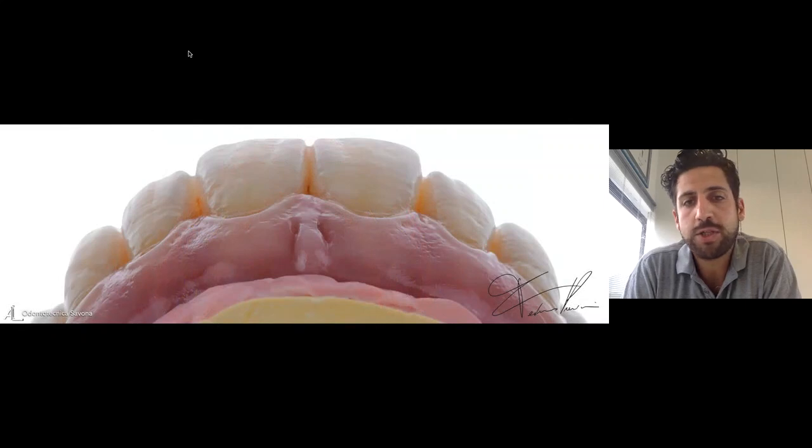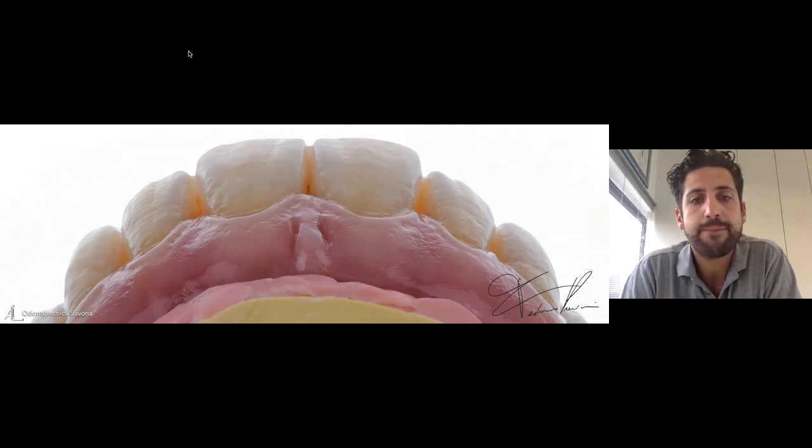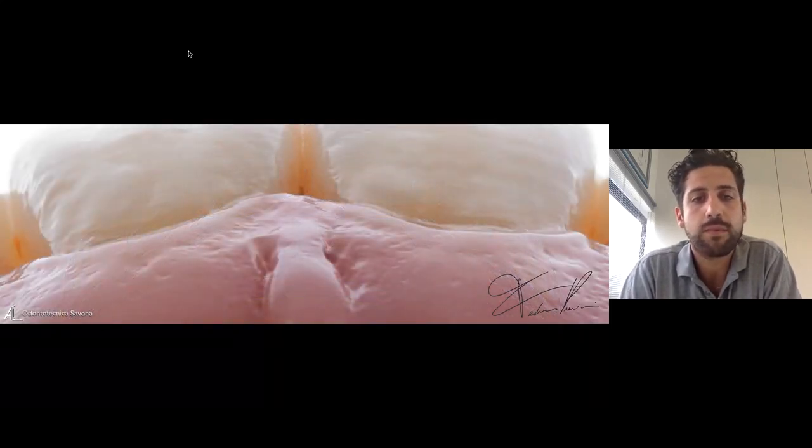And these are some pictures, always with the white light, to see the surface of the gingiva, our texture, our frenulum. I want to just show some pictures now.